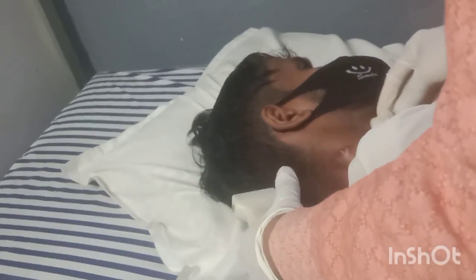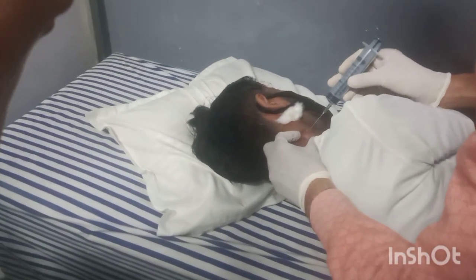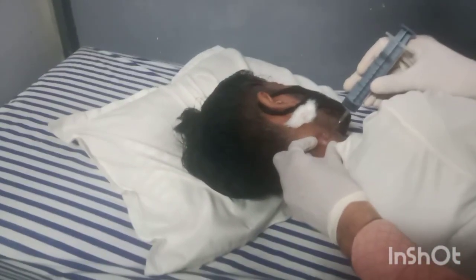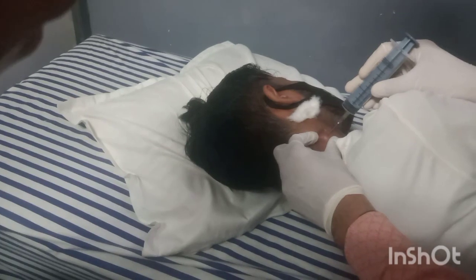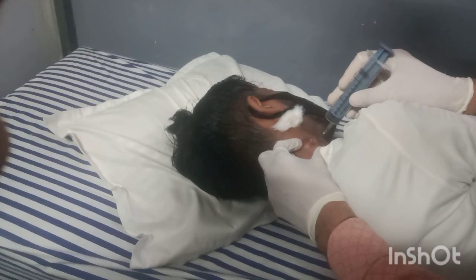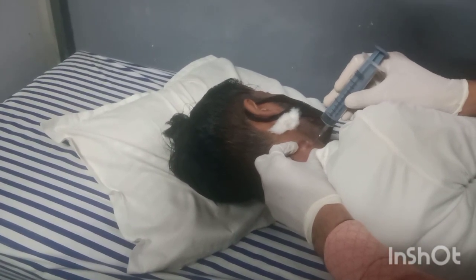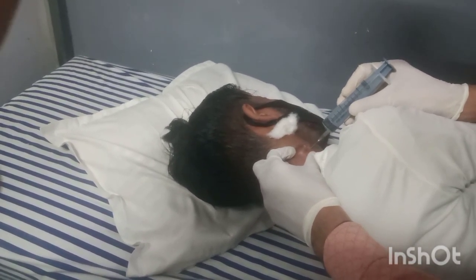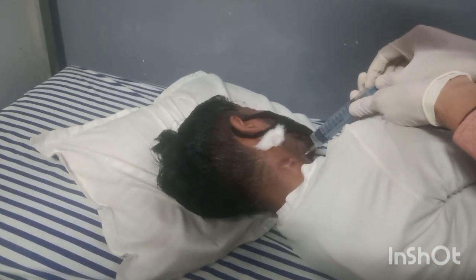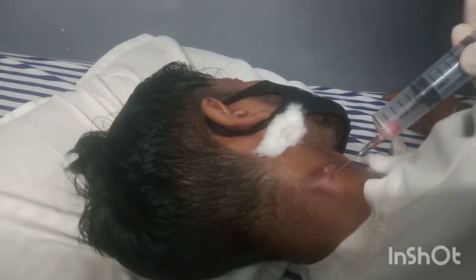Now we are going to inject a needle. We are going to inject. The needle is moving up and down. Material is coming up.